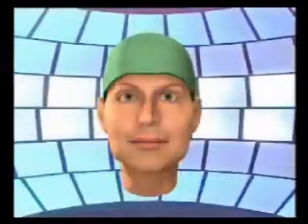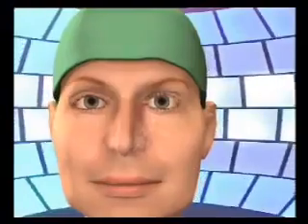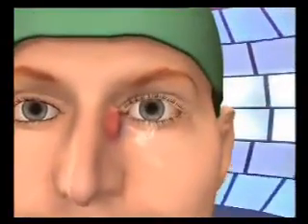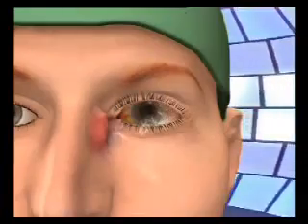Opening the lacrimal sac, drainage to the nasal cavity, and restoration of normal tear function. Failure of the tear drainage system leads to epiphora and repeated infection, which could jeopardize the integrity of the orbit and eyeball.